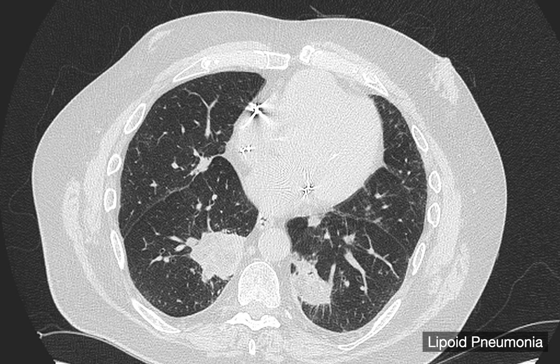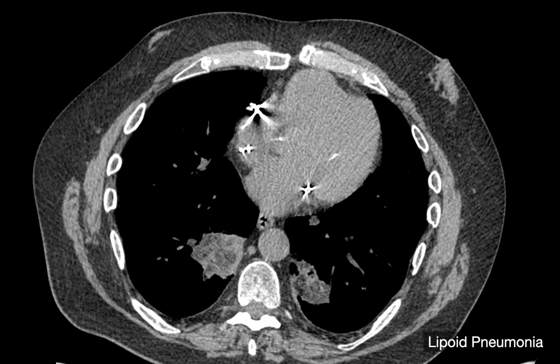In cases where the lipid concentration within this area of inflammation is high enough, you actually will see areas of fat attenuation within this mass. Here is an example of one of those cases — there are actually masses in both lower lobes in this patient. They look kind of ugly on lung windows, but if we move to a soft tissue window, they take on a very specific appearance as we start seeing areas of macroscopic fat within this mass. Something like this is highly specific for lipoid pneumonia.